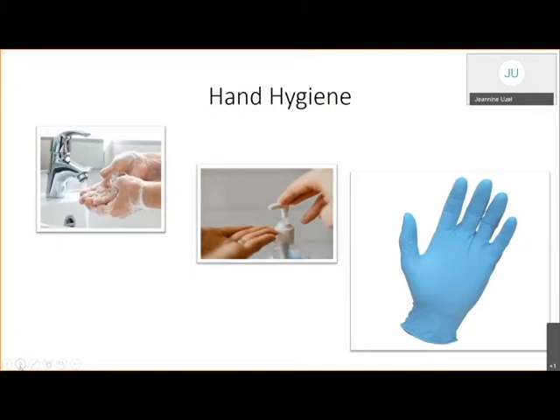Before touching the patient or preparing the vaccine, wash your hands either with soap and water or use a hand sanitizer solution. Hand hygiene should be performed before vaccine preparation, between patients, and anytime hands become soiled. Gloves are not required when administering vaccines unless the person administering the vaccine is likely to come into contact with potentially infectious body fluids or has open lesions on the hand. If gloves are worn, they must be changed and hand hygiene performed between every patient.